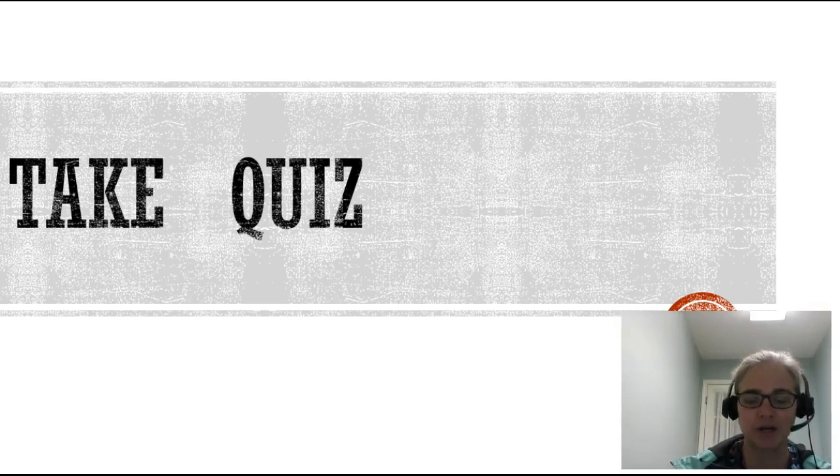Number 6, to run a test, you need 10 drops of urine on the cassette. That is false. You only need 3. So just remember, if you put too much in there, it might actually affect it. So remember, you only need 3 drops of urine for the cassette.